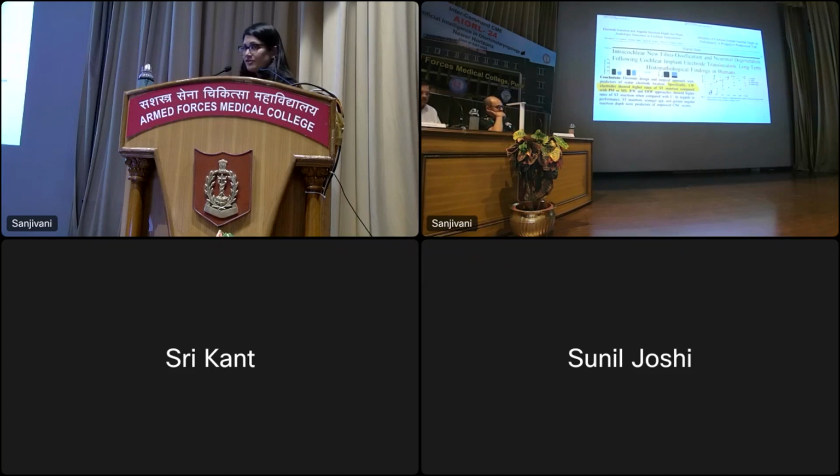Another thing is telling you about structure preservation. Why is it important? Because when you deviate into another scala, changes like new fibroossification and neuronal degeneration happen. When you deviate from the scala tympani into another scala, you're mixing the fluids, that is the perilymph and the endolymph. And these are the changes that might happen. And this study has been published as well.